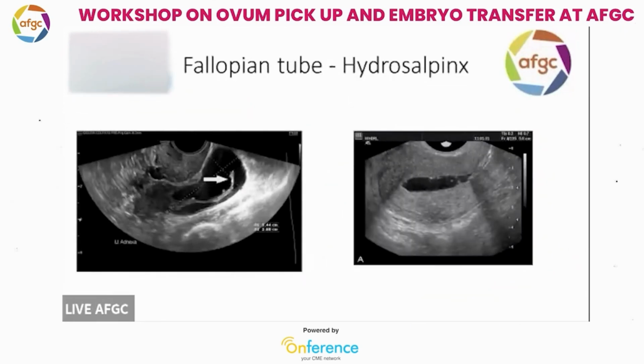There's still echo, please reduce it. Okay, so the fluid in the cavity comes either because of menstrual blood, hydrosalpinges, or pelvic infection, or during stimulation, where the stimulation fluid settles on its own. The menstrual fluid will settle on the 7th or 8th day. Pelvic infection and hydrosalpinx will come and go.